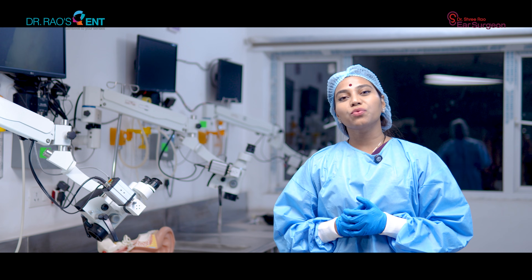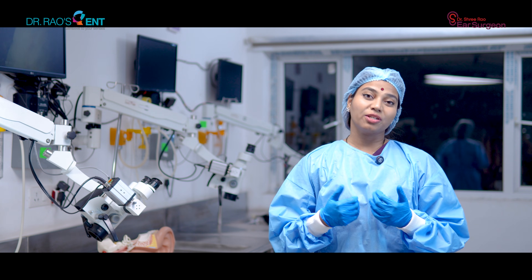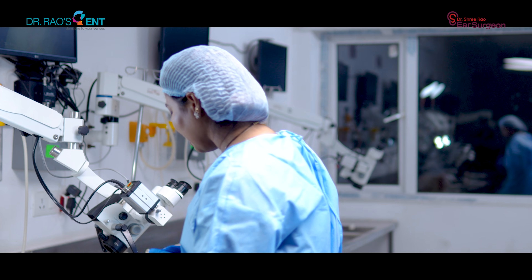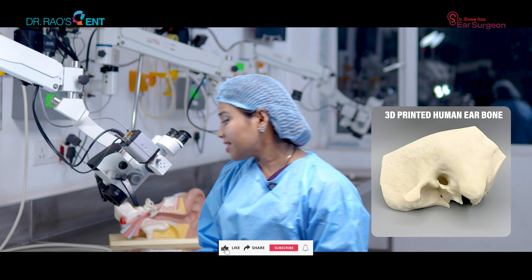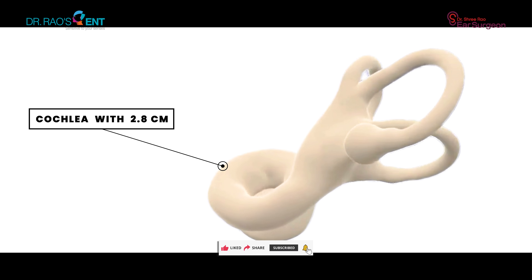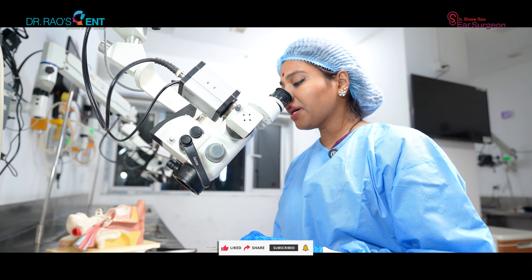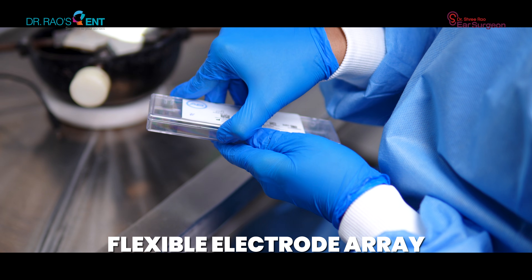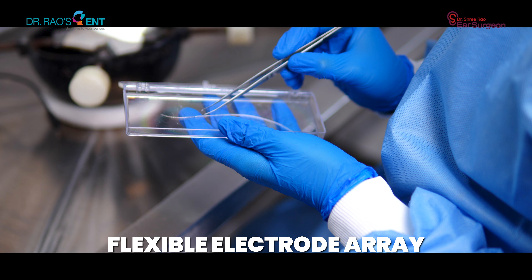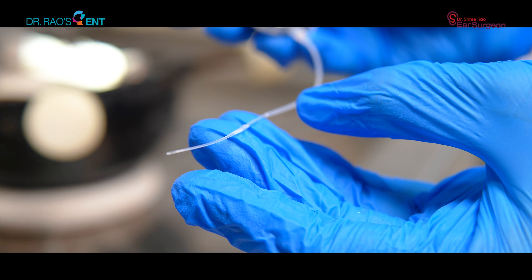Let me tell you how the interface with the brain is achieved surgically. We are inside the skills lab, the temporal bone lab. This is a 3D printed human ear bone. Inside it is a tiny cochlea which is 2.8 centimeters in size. My job is to insert this flexible electrode array, designed very carefully by our scientists, into the cochlea.